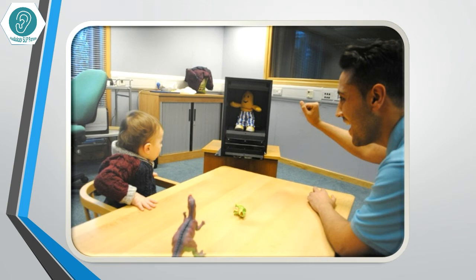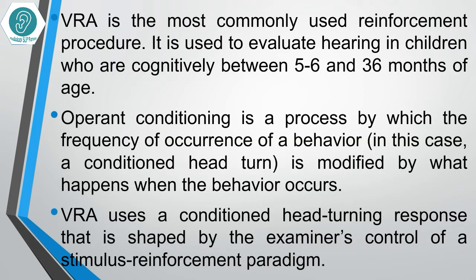In this picture you can see how VRA is performed. VRA is the most commonly used reinforcement procedure. It is used to evaluate hearing in children who are cognitively between 5 to 6 and 36 months of age.